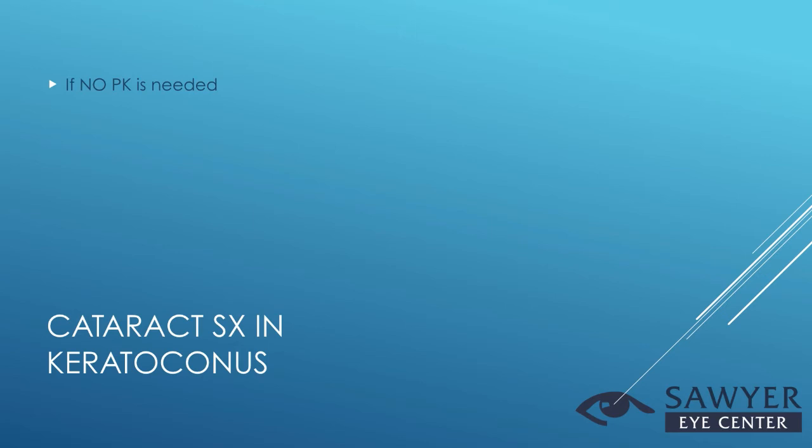So if they have keratoconus but no PK is needed, then a lot of this has to do with whether a patient will wear a scleral contact or not. If they have a large amount of astigmatism, and this is going to play into a lot of the things we're going to talk about from here on out, but with keratoconus, they usually do have a large amount of astigmatism, and they will wear a scleral contact, then I'll put a regular intraocular lens in their eye. If the patient will never wear a scleral contact, then I will put a toric lens in their eye if they would like that.